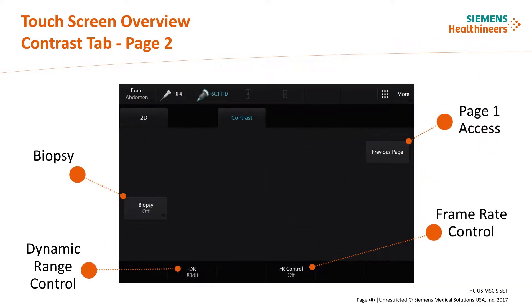Page 2 contains features that are used less frequently or already preset in the selected exam: biopsy, dynamic range, or frame rate control. To return to page 1, the user selects the previous page icon.